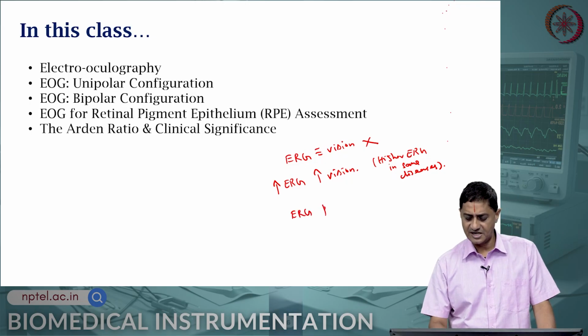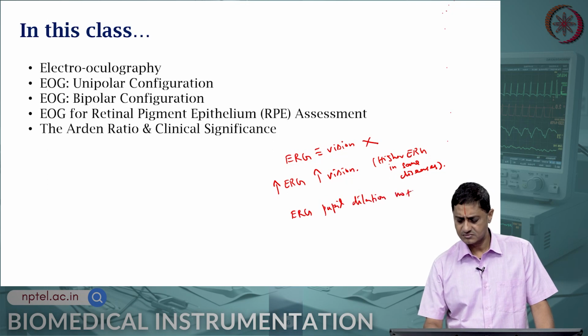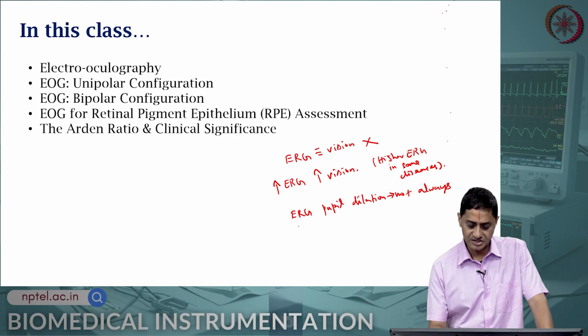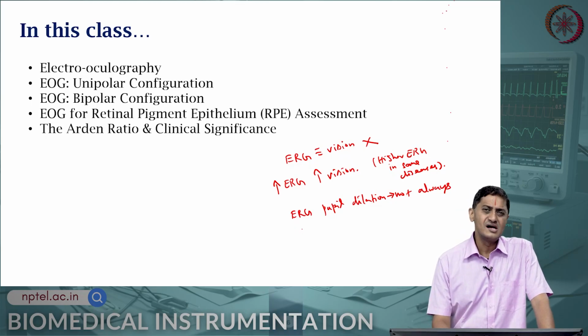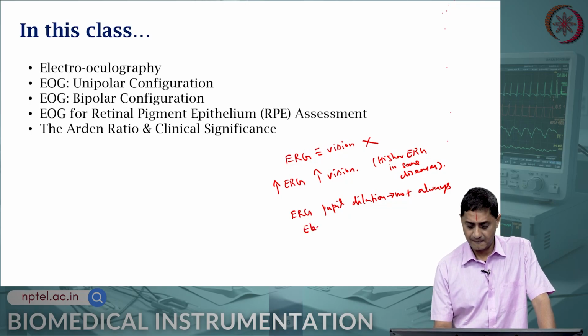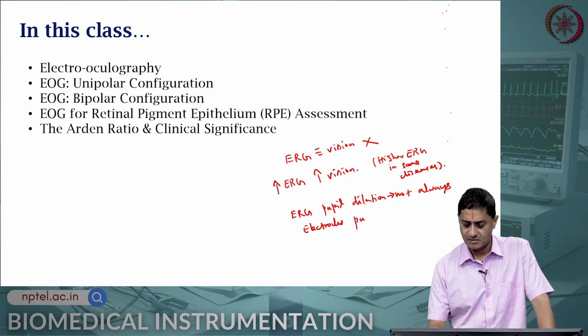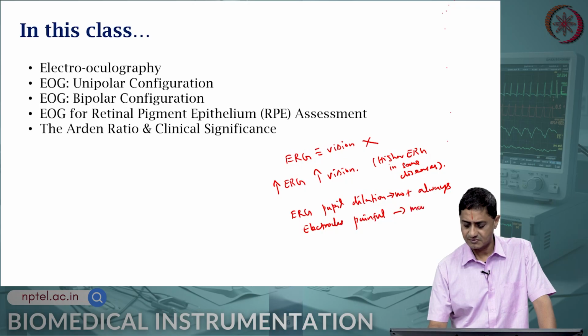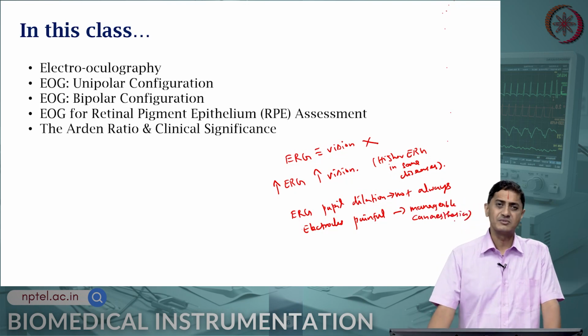ERG requires pupil dilation. Not always true. Depending on the protocol and depending on the study of interest, it may or may not require pupil dilation. Fourth, corneal electrodes are painful. If we give proper anesthesia, then the pain may be managed. Something to keep in mind.